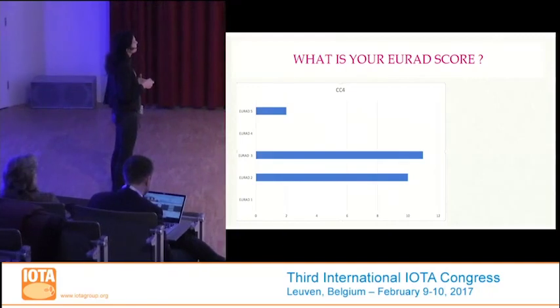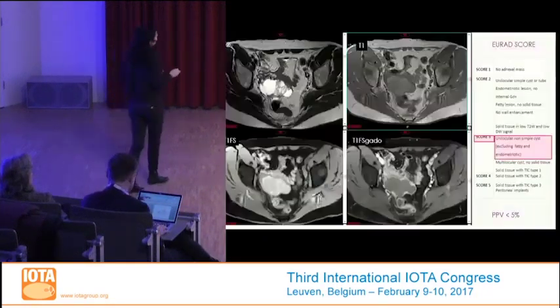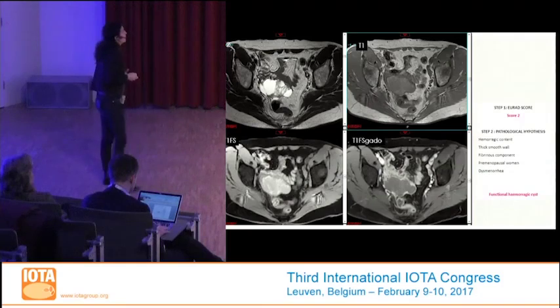Not everybody agreed, but finally most people think, okay, it's probably benign, because the risk is lower than 5% using MRI, and the right diagnosis was functional lesion.